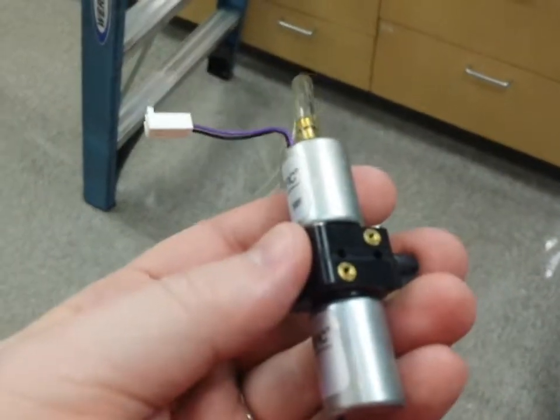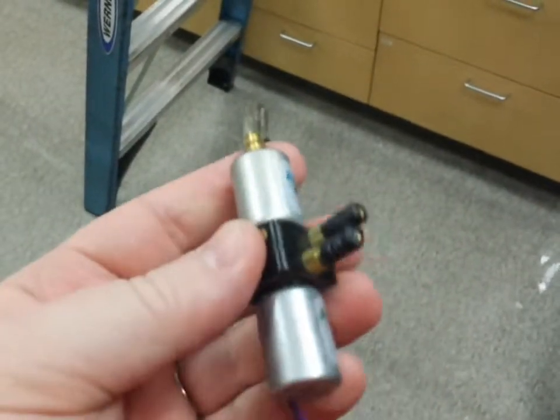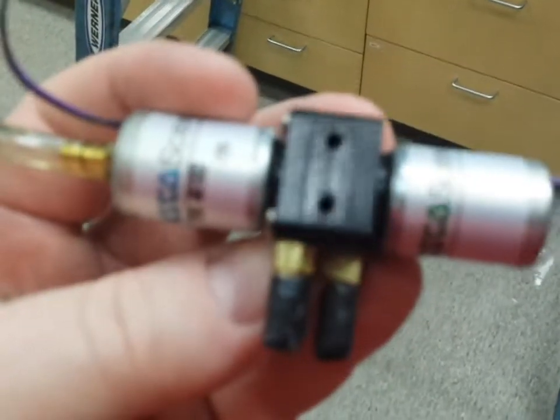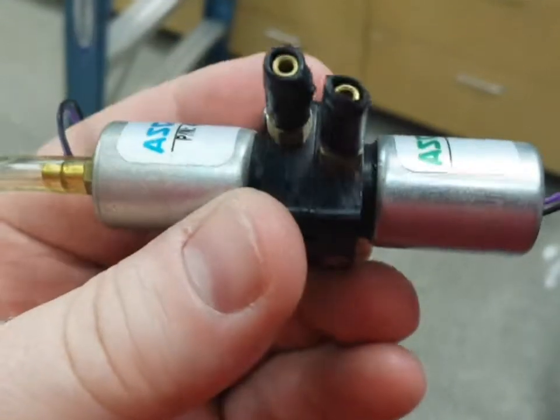Once you have all four of those clips removed, the two screws on the back of that valve will let you remove it from the board itself. Then the wiring just unplugs.